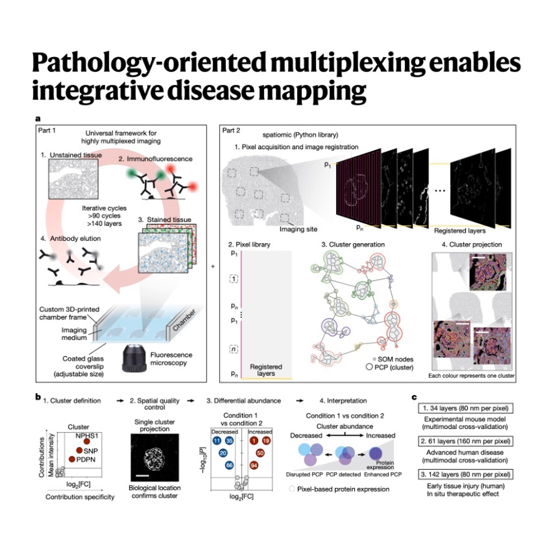So, okay, we need a finer lens, and you've brought us something new today, a framework called pathology-oriented multiplexing, or PathoPlex. Sounds like it's designed for exactly this. It is, yeah. PathoPlex is built to overcome that resolution and integration barrier. It's basically a new workflow combining really high-res imaging, at the subcellular level, with some clever software.